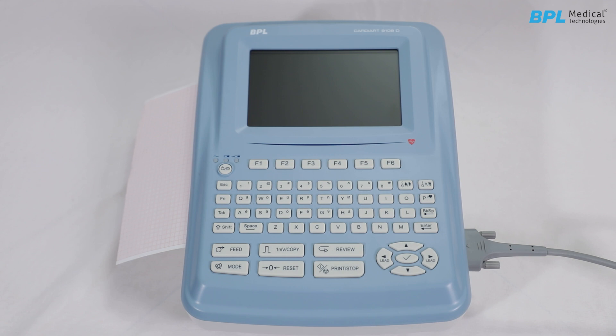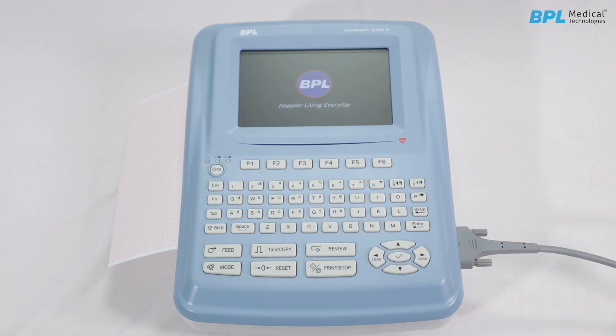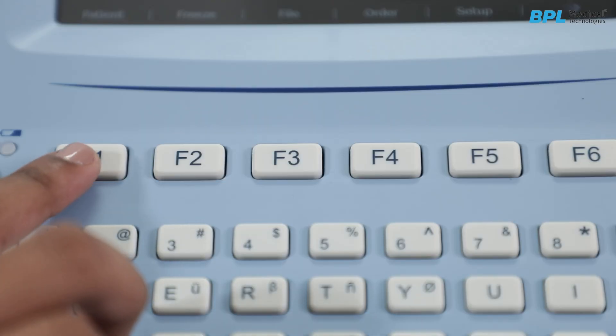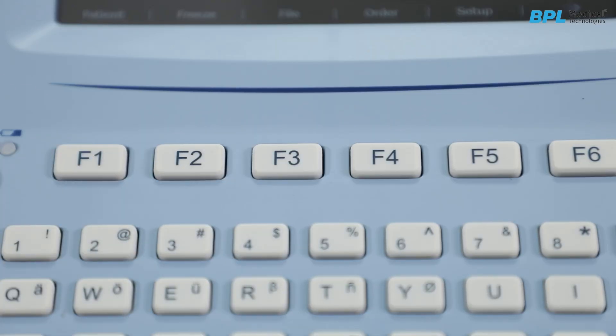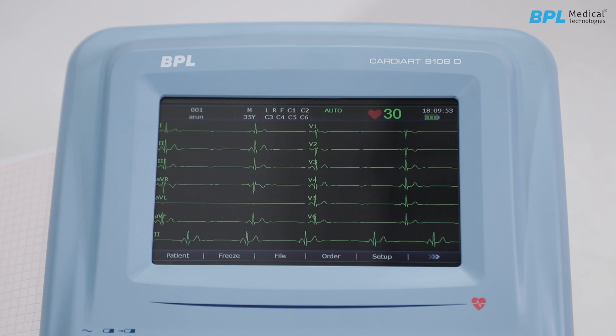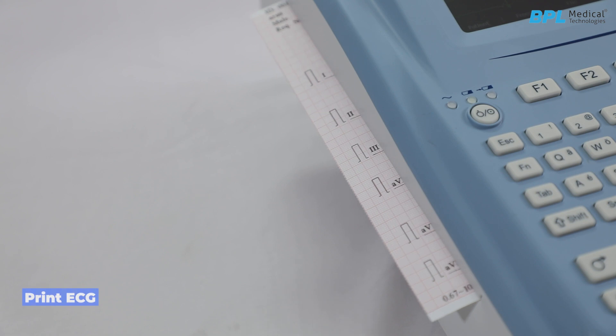To operate, turn on the ECG machine by long pressing the power on/off key. The LCD screen will be displayed after self-test. Navigate to the main screen and initiate the ECG recording. Press F1 to open the patient information and input the ID, name, gender, age, and pacemaker status. Age and gender are mandatory for the interpretation algorithm to function accurately. Once the ECG waveform is displayed, press Print or Stop to sample and print the ECG.